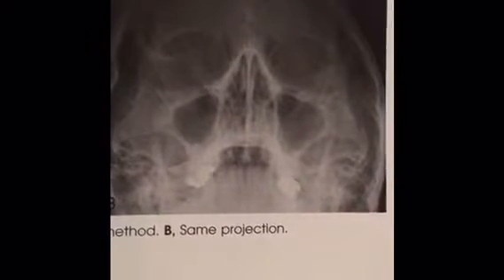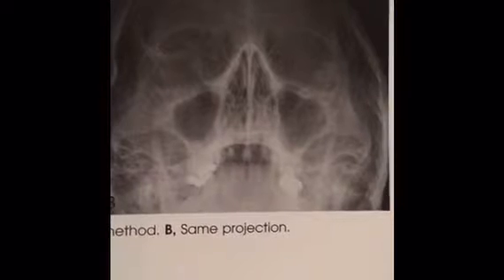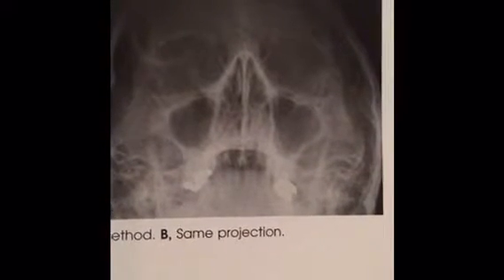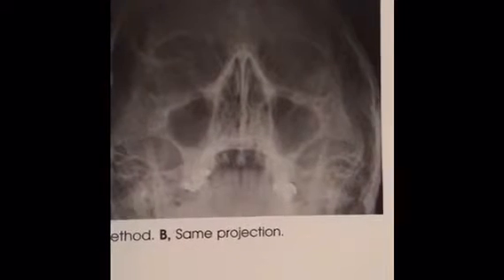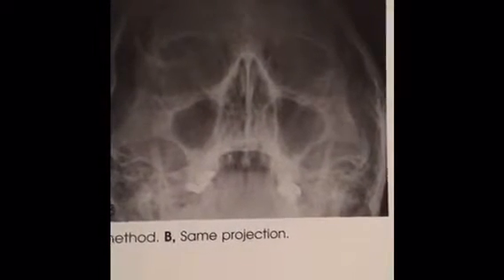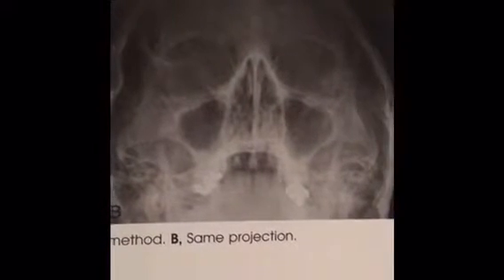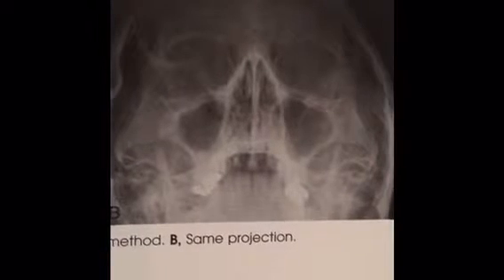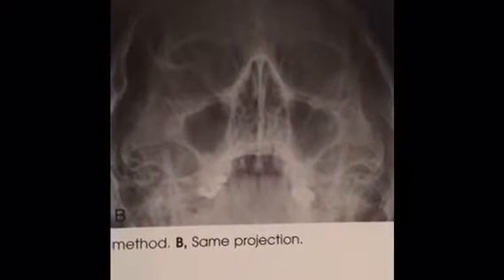The next image is going to be the parieto-acanthial projection, which is the Waters method. And for this projection, the evaluation criteria is going to be, you're going to see the maxillary sinus. You're going to have the OML in proper position, and this is demonstrated by the petrous pyramids lying immediately inferior to the floor of the maxillary sinuses.